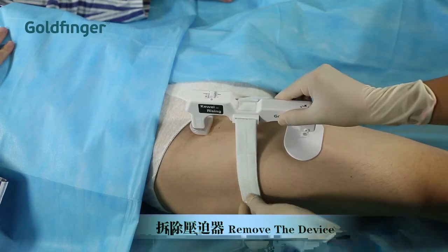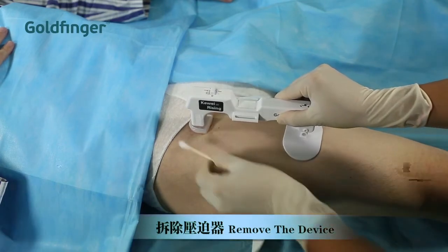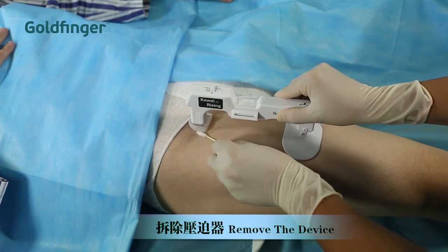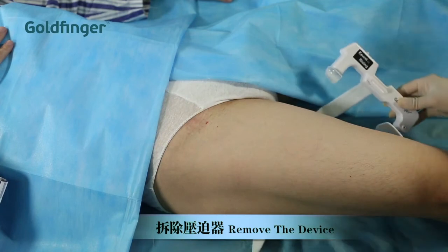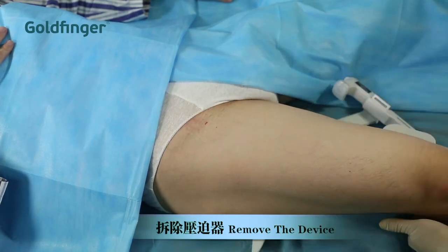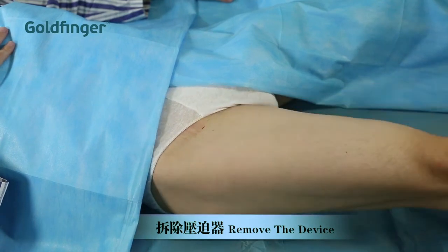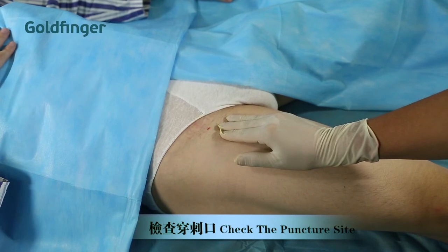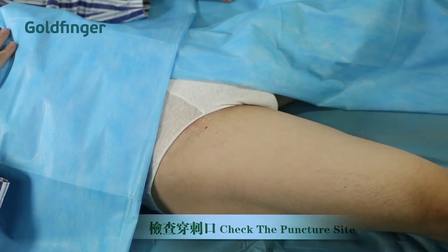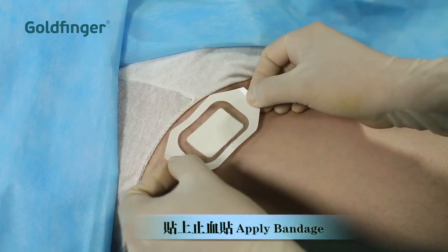After extended periods of contact, the silicone dome might stick to the skin. An alcohol swab inserted under the dome, as it is being removed, will facilitate easier removal. Proceed gently to avoid opening the wound.